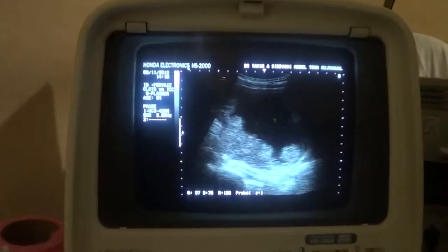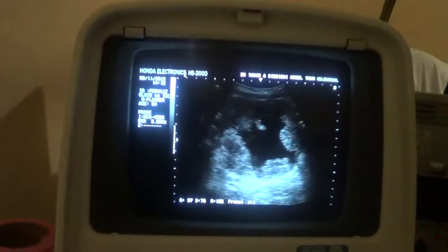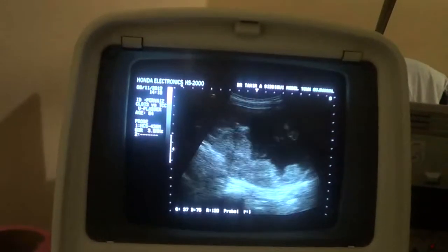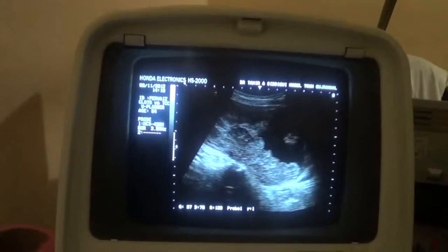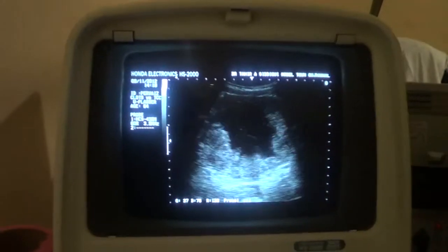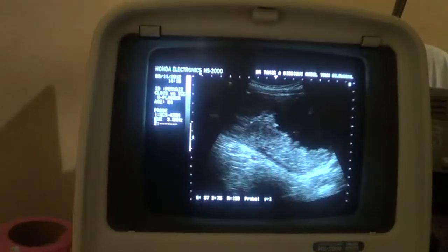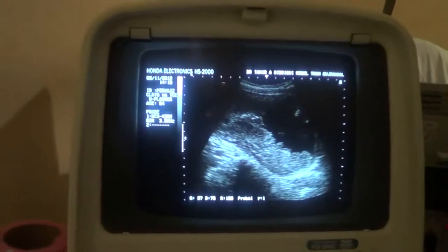Okay, this is a view in front of you, that of the urinary bladder of a male aged 54 years with a lot of thick echogenic material seen fixed to this wall.